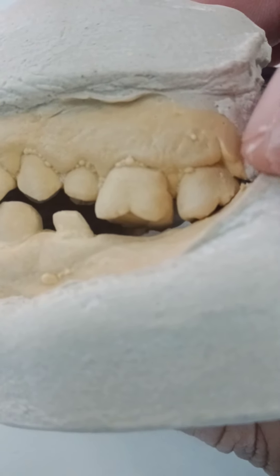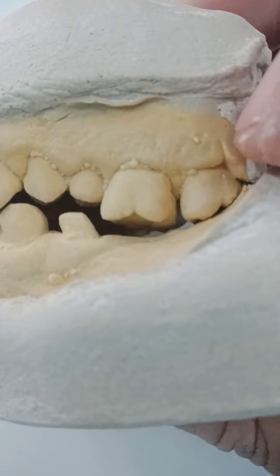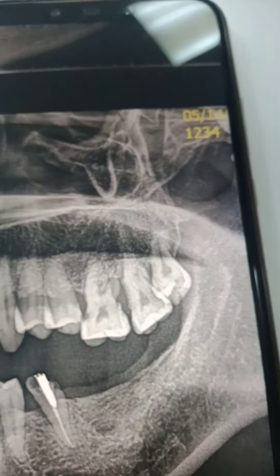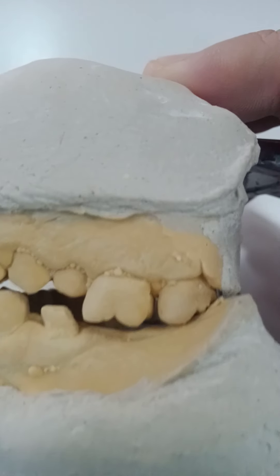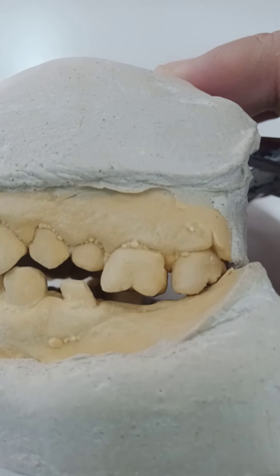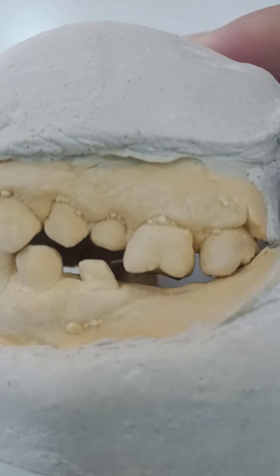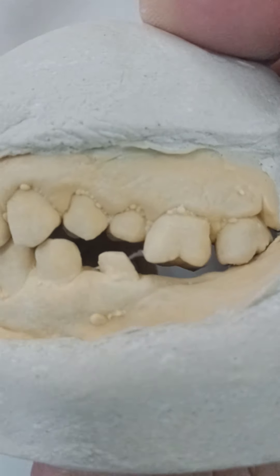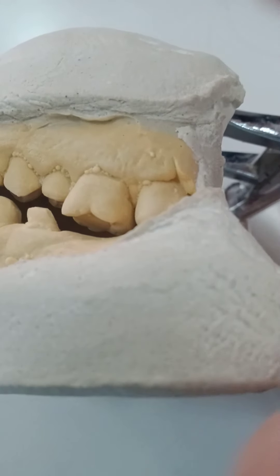There is an eighth tooth here, but I could see it on the x-ray. By the way, this is the bite — the mounting is incorrect.